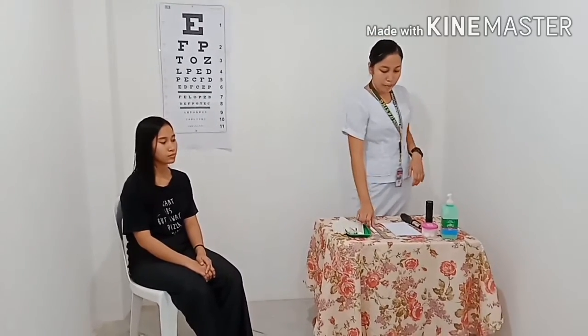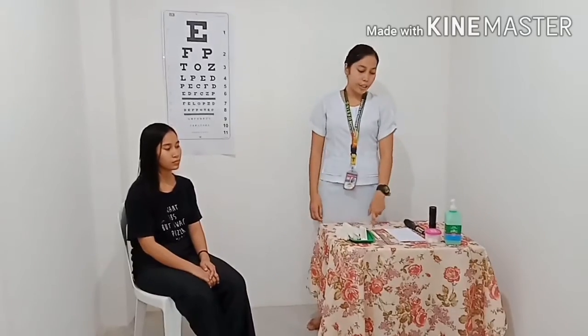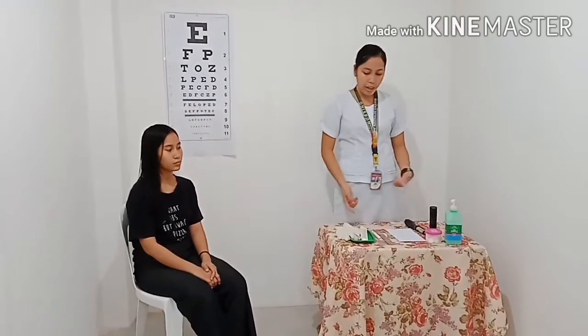So first is to prepare all equipment that we're going to use throughout the demonstration, such as the wooden tongue depressor, cotton applicator, the pen light, millimeter ruler, the OPA card or index card, the gloves for infection control, then the flashlight, the improvised otoscope and tuning fork.